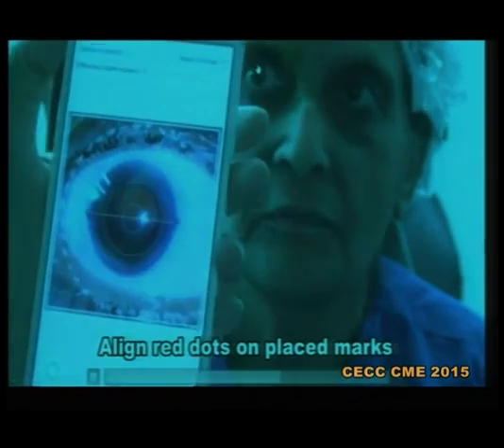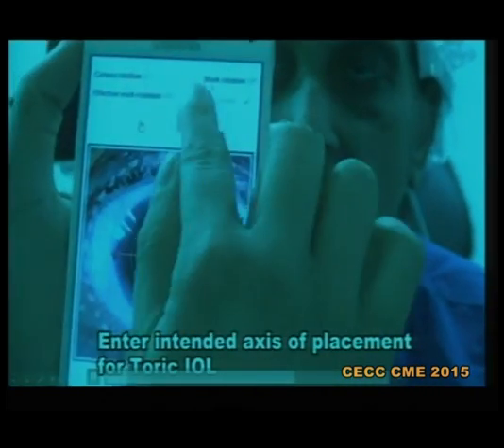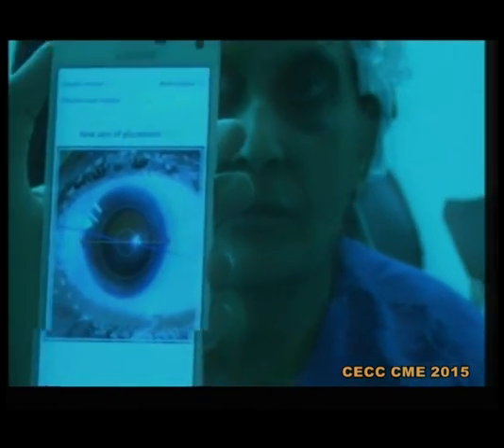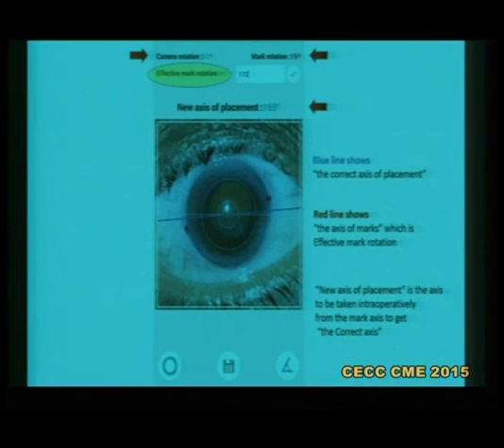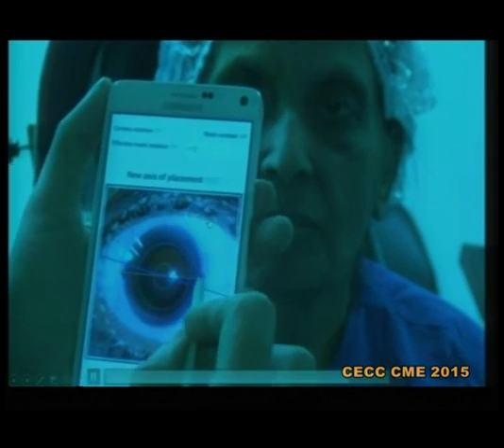It will give you readings in the form of what was the camera rotation at the time of taking the picture and what was the effective mark rotation. Here, as you can see, it is a four degrees mark rotation. You just have to enter the axis at which you want to place the IOL. I have to place the axis at 173. There was a mark rotation of four degrees, so this application will give you that the new axis of placement should be 169. From the marks that you have made, you have to place the IOL at 169 degrees instead of 173 degrees — it will correct the error made while marking the cornea.